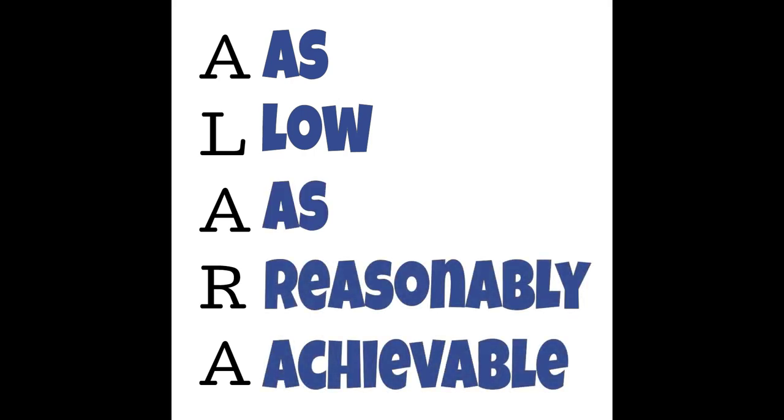So we as sonographers need to follow the principle called ALARA. ALARA stands for as low as reasonably achievable. You should know this. As low as reasonably achievable means that we are going to use the least amount of power possible so we don't increase our patient's risk of bioeffects, but we still optimize our images appropriately. What this typically comes down to is increasing your gain first if your image is too dark, and decreasing your power if your image is too bright.